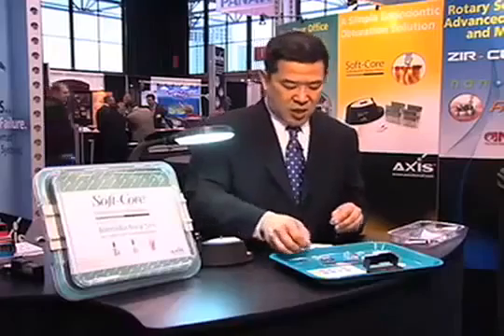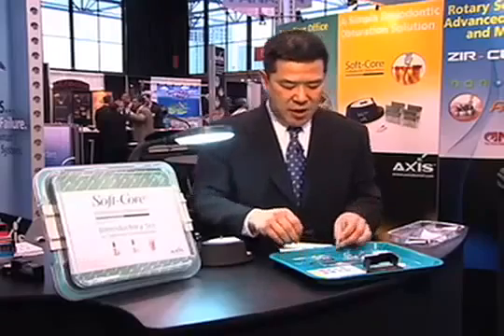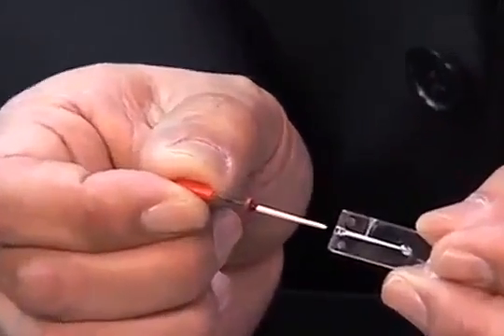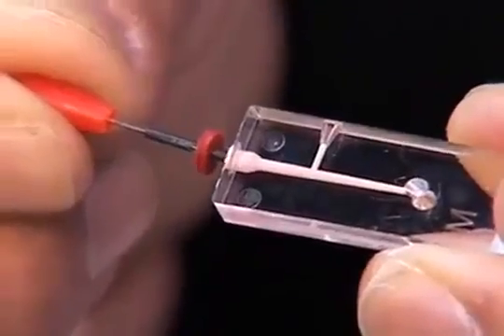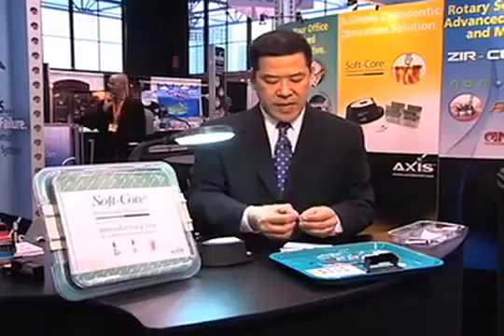Okay. So here we are. We're going to take an obturator, and let's go back and take the obturator that I've already coated with the cement, and when this beeps, I know that the gutta percha is warm and ready. I'm going to take the obturator and simply, without twisting, seat it straight down all the way to my working length. And then I have one here that's already set.